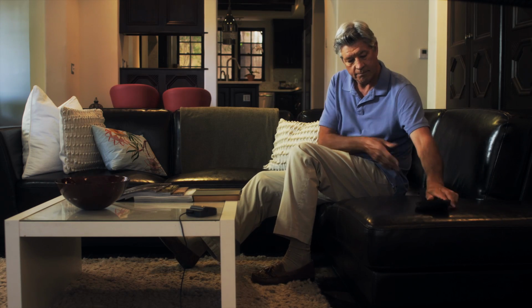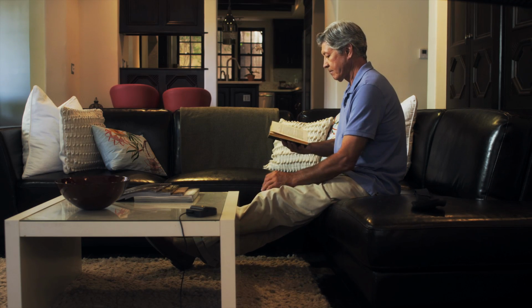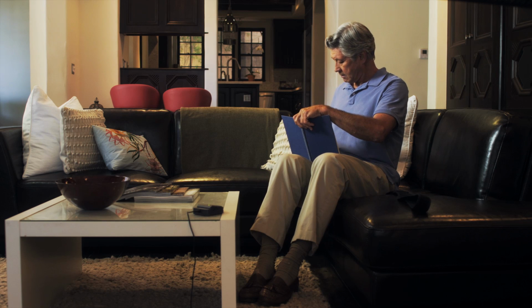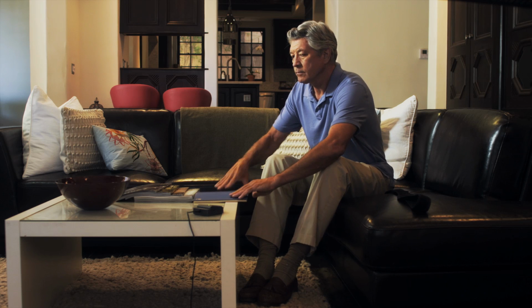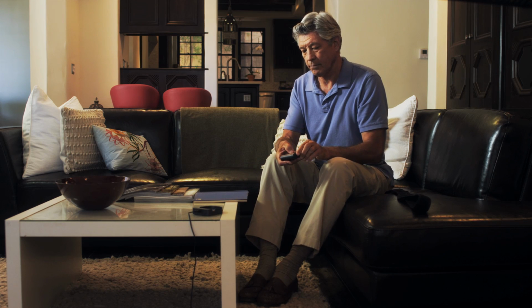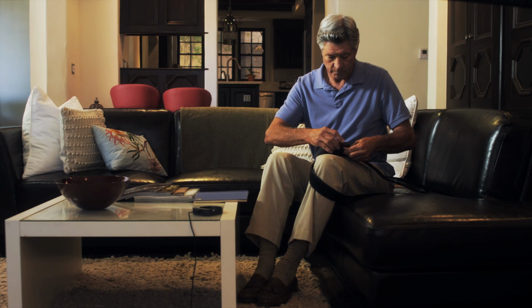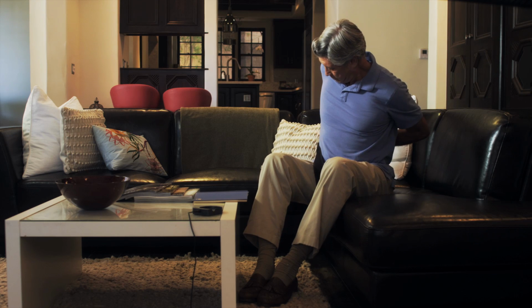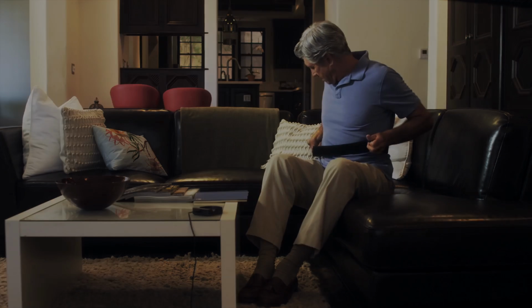To make sure you have a full charge, wait until the charger makes an end-of-charge beep signal. You can also check the remote control display to see if the battery is fully charged. Whenever the remote control indicates a low battery, the stimulator should be recharged as soon as possible. With each charge, wait until you hear the double beep to ensure that you've completely recharged your battery. You can also check your remote control indicator after charging to see if your battery is full.